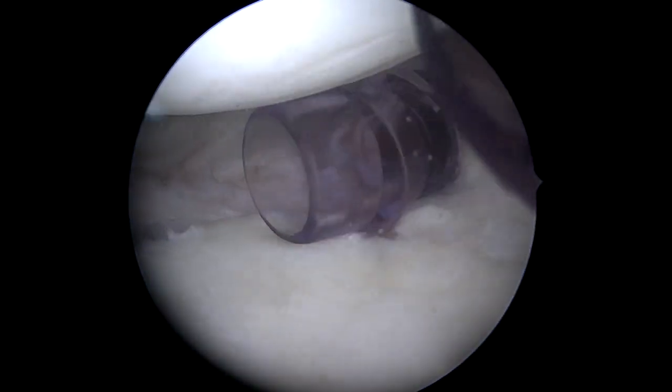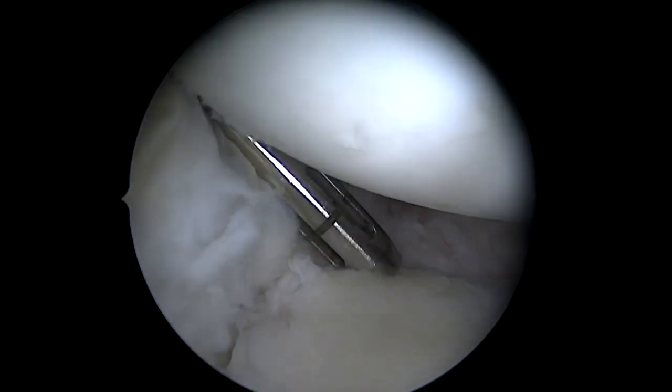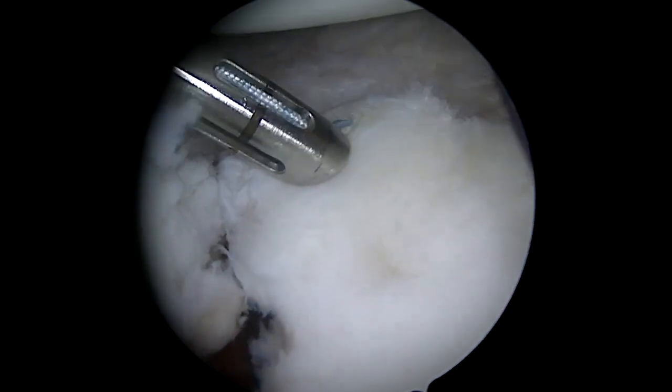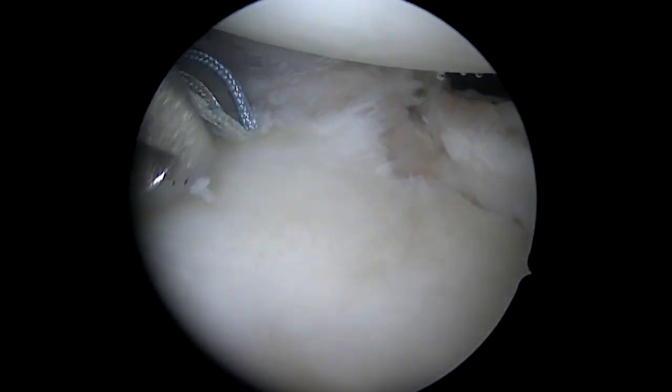This is all done arthroscopically — there are our cannulas in place, with a seven o'clock portal. Before the main fixation, I'm going to place an anchor at the inferior aspect, just below the site of the bone, and use the soft tissue to aid in our reduction and fixation.